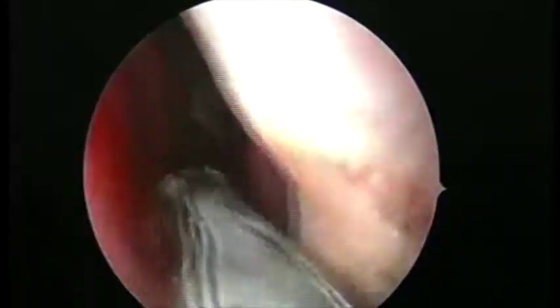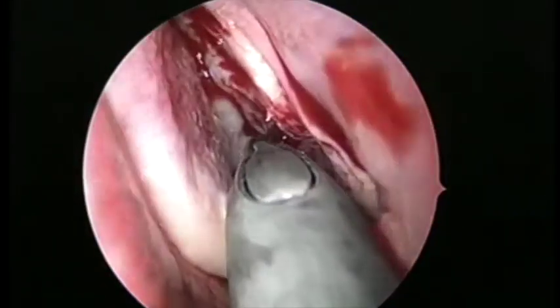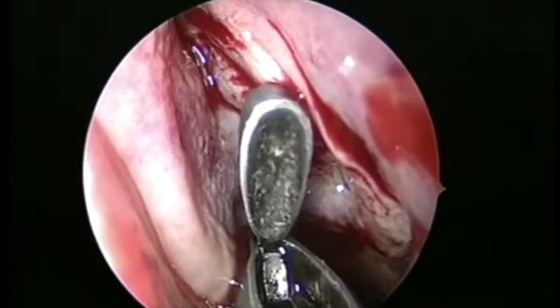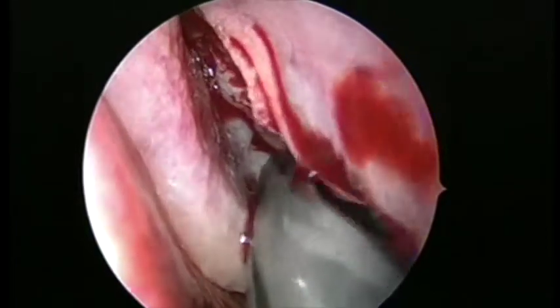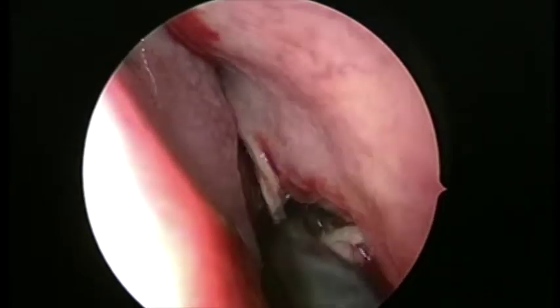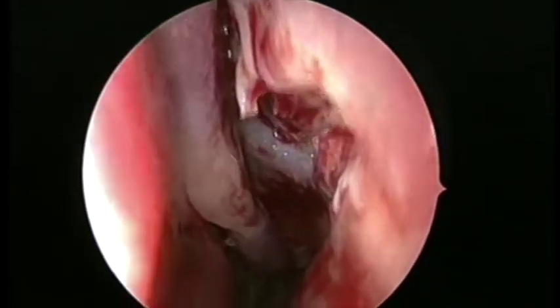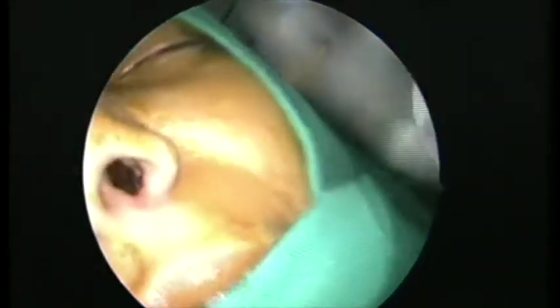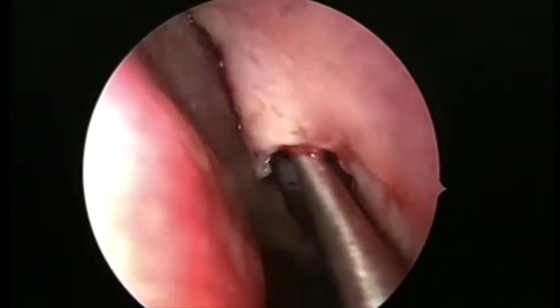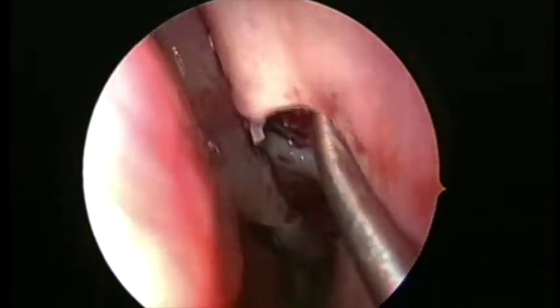This is my reverse cutting. I put the instrument in first, followed by the endoscope. When I reach the area where I want to remove the uncinate process, I open it and curve it laterally to engage it in the uncinate process. We make one cut, then two cuts. Next, use the ball probe and put it inside the ethmoidal infundibulum and gently open the ethmoidal infundibulum.